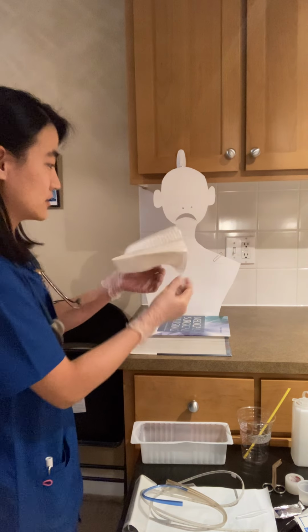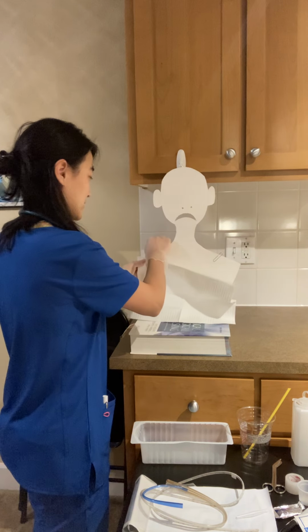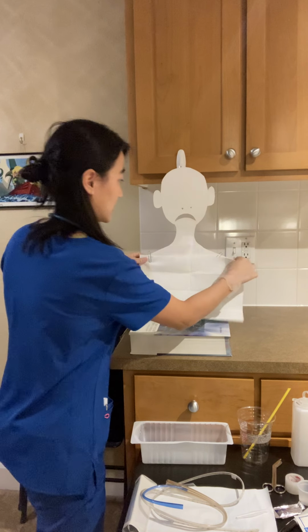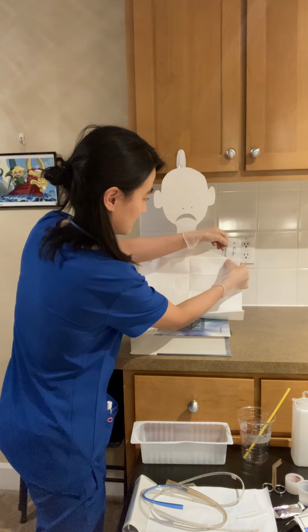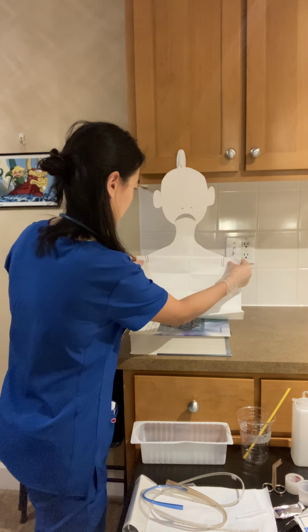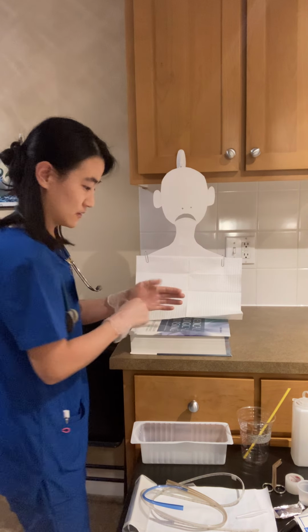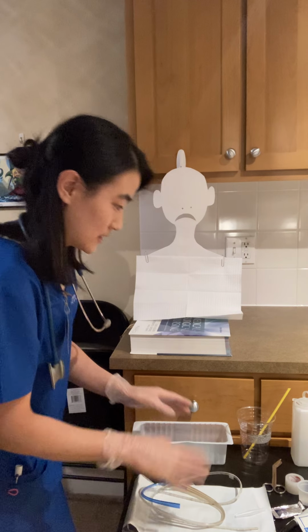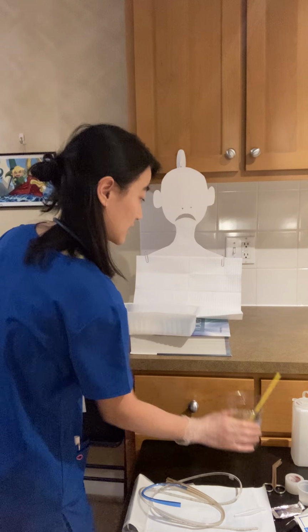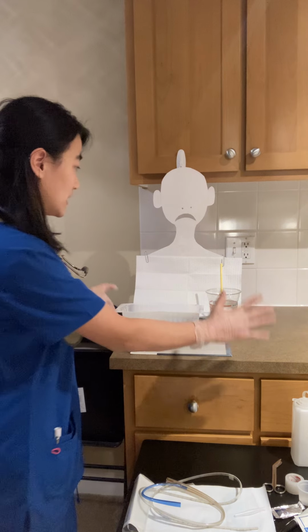Also going to just put a towel over his chest to protect him from any leaks or spills during this process. Alright, and then I'm also going to hand him his emesis basin and a cup of water. So Mr. Nguyen, here's an emesis basin for you and a cup of water.